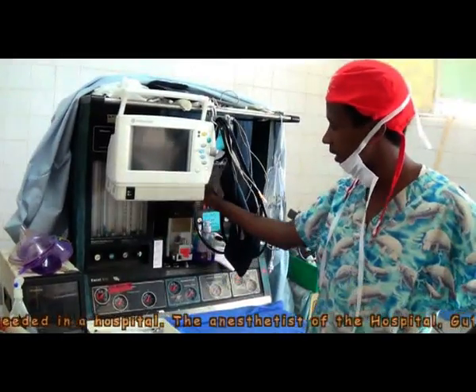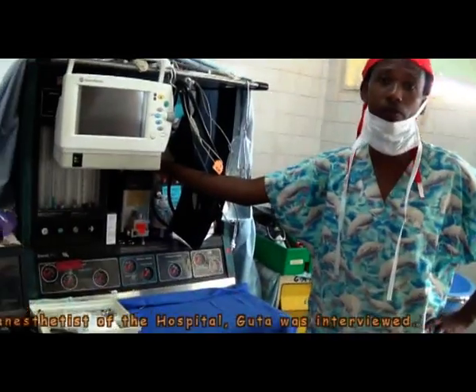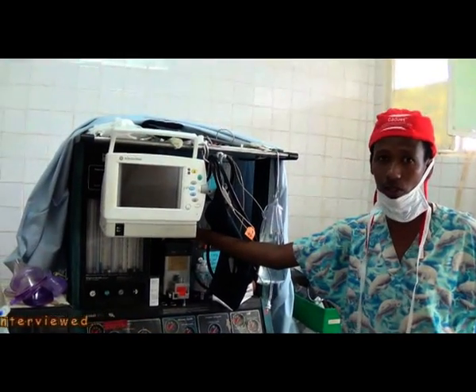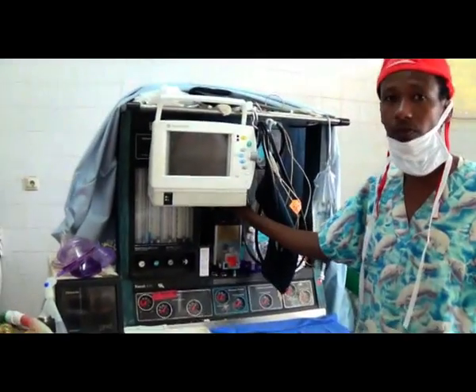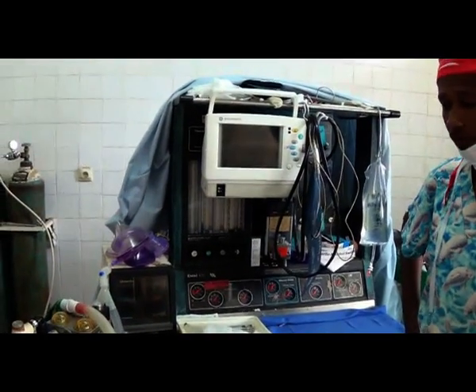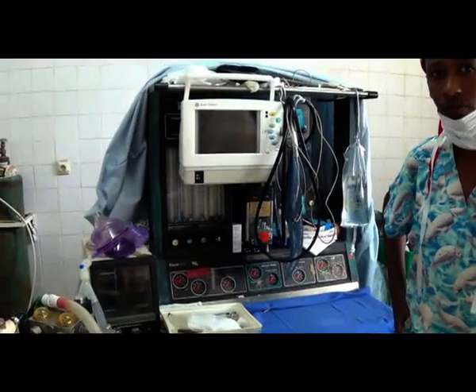Since it has a leak, there are inhalational agents here. When I give them, the patient may feel pain. Because the machine has its own leak, the patient will not gain enough concentration of inhalational agents. This is because of the partly non-functional state of its different parts, so the patient under anesthesia is not getting what he has to get.